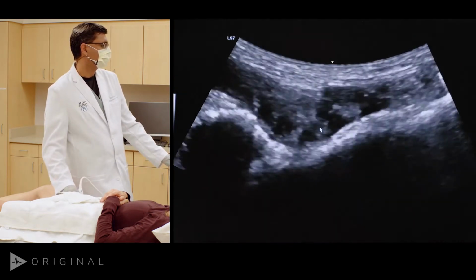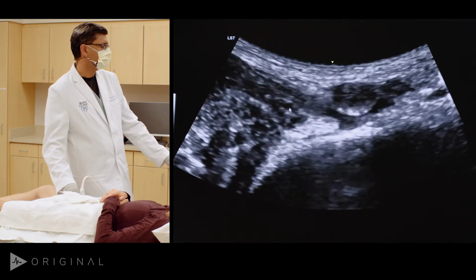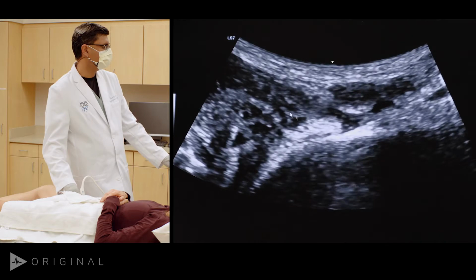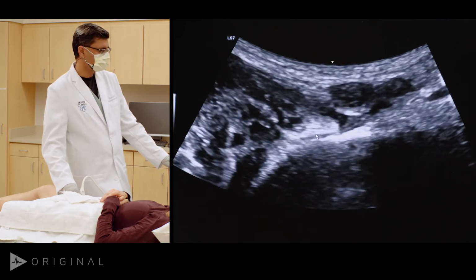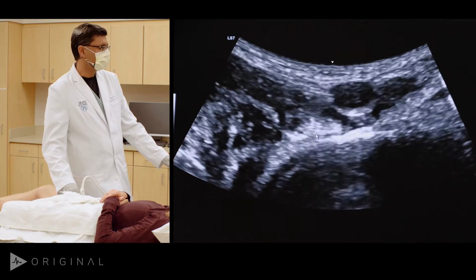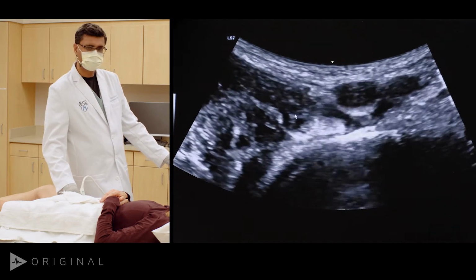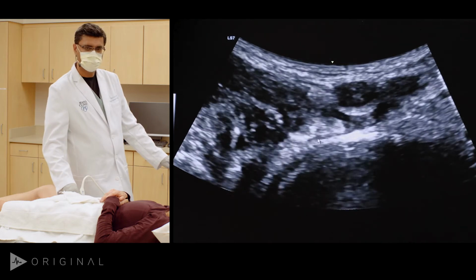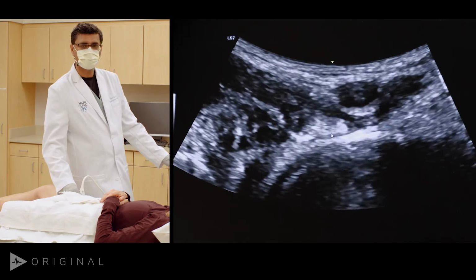So here is the hyperechoic iliopsoas tendon. That is the iliacus muscle, so the iliopsoas muscle tendon unit. When patients generally externally rotate and abduct their limbs, what happens is a part of this muscle goes under the tendon. And when the tendon flops back in view, that's what causes the snap.